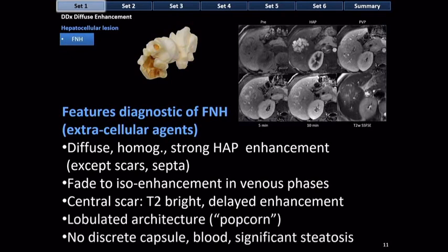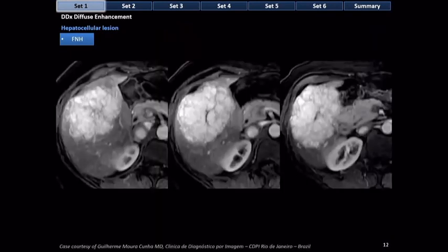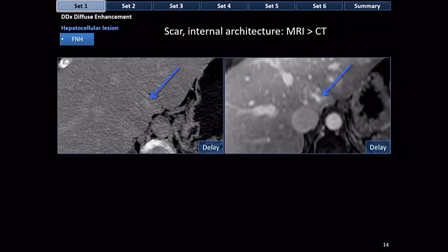Delayed enhancement of the central scar can be helpful. MRI with an extracellular agent is more sensitive to the enhancement of the central scar than CT. The reason: MRI is more sensitive to gadolinium than CT is to iodine — anything that enhances will be seen better on MRI. Practical teaching point: if you do a CT and think it's FNH but aren't positive, doing an MRI is a very reasonable next step.